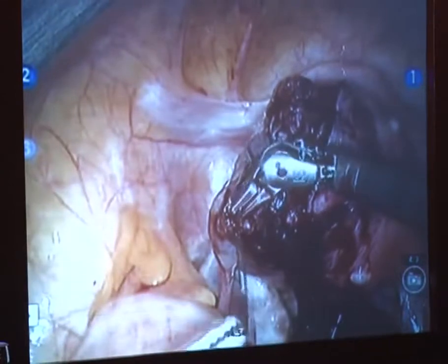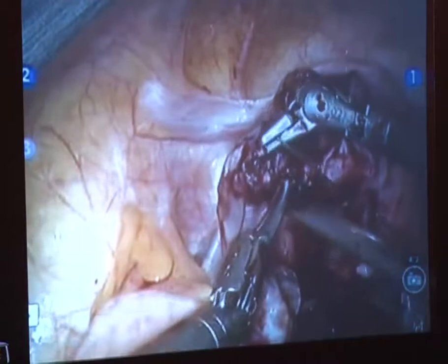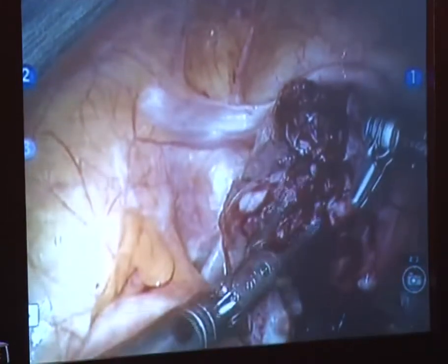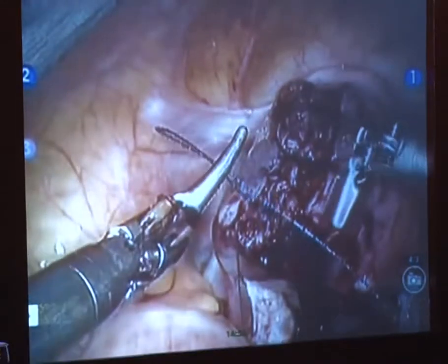Now, what I'm going to do is sew back on myself and double back and do the next layer, which is going to be a full thickness bite to close the next layer. So, we're going to come out here.